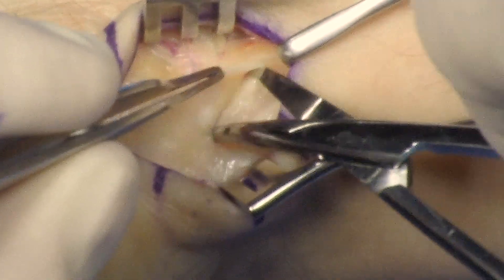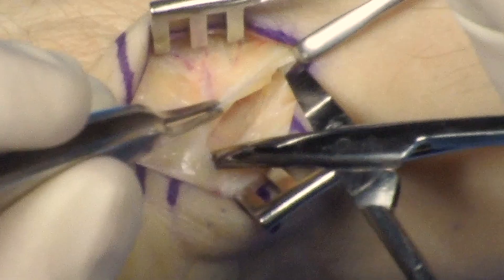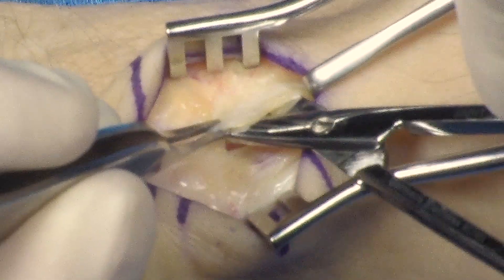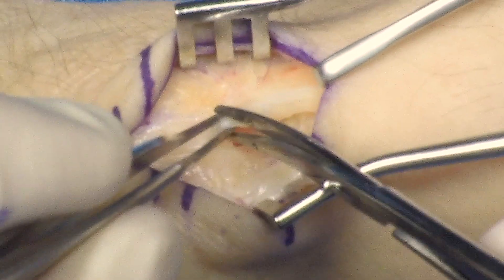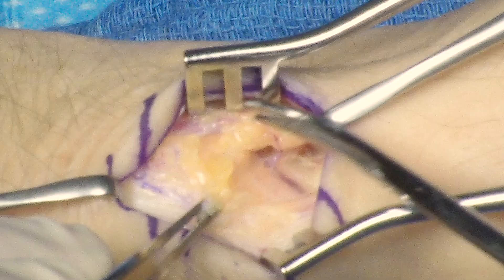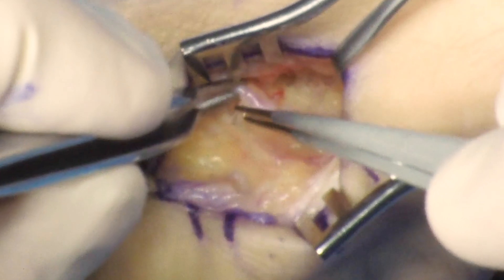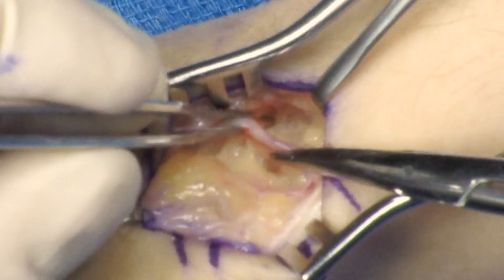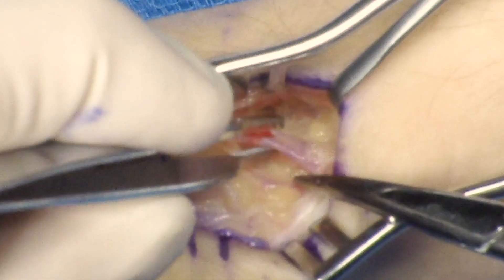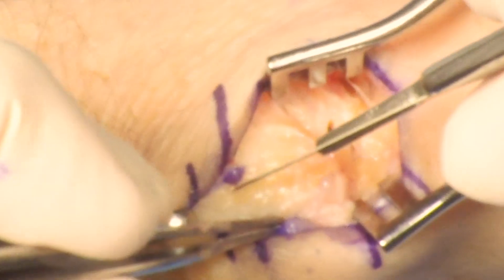The dissection is then taken down with identification of the deep branch of the radial artery. Tissues are mobilized superficially over the artery. Small branches of the radial artery going into the joint are divided and cauterized. The artery is mobilized.